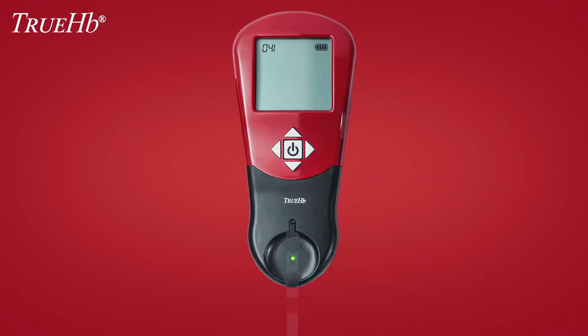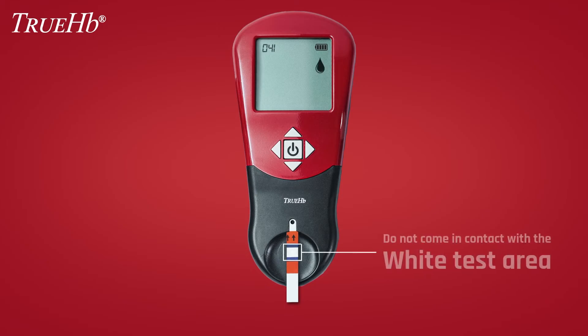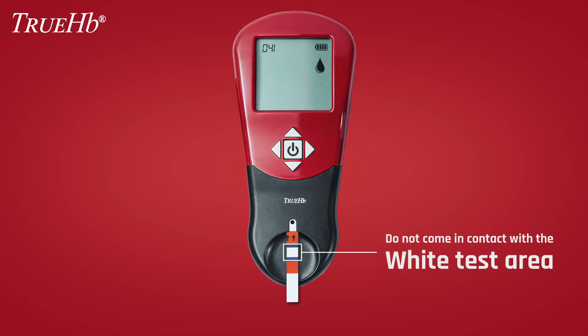Insert a fresh strip into the meter. The arrow in black should be pointing towards the device. Immediately after inserting the fresh test strip, the display will flash the blood drop symbol. Do not allow fingers or other foreign objects to come in contact with the white test area of the test strip.